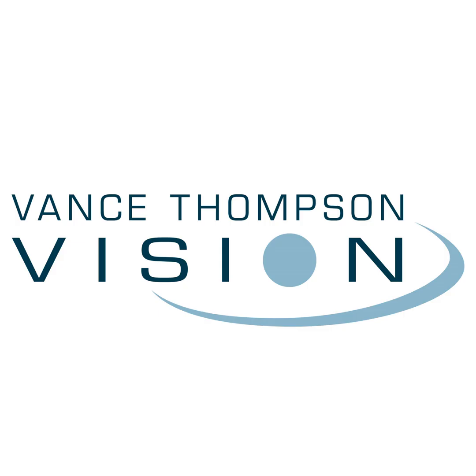Yeah, I've got a whole slide deck of patients where I like to pull up the Pentacam and ask, would you do LASIK on this patient, yes or no? Then I flip over to the epithelial mapping, and it has pushed me one way or the other multiple times. It'll make me a lot more comfortable doing a LASIK procedure on inferior steepening because I see that the inferior epithelium is thick. So why would we do LASIK? Why not just be safe and do PRK?